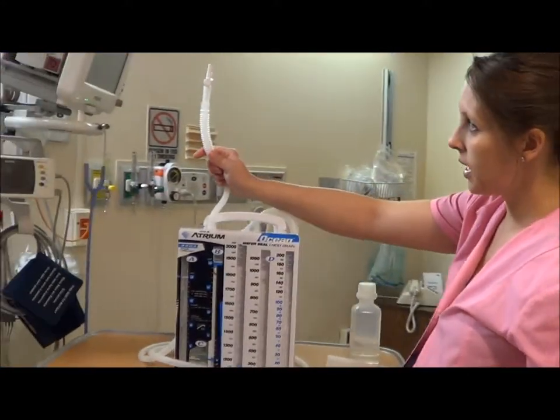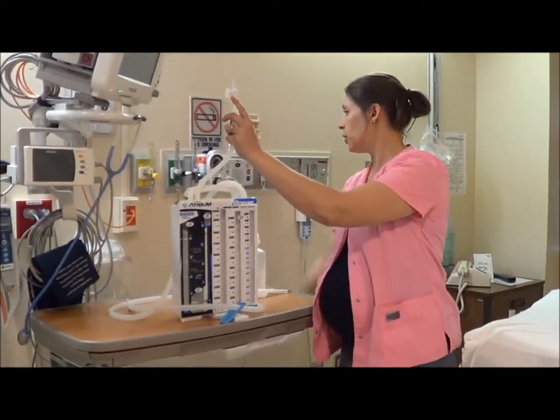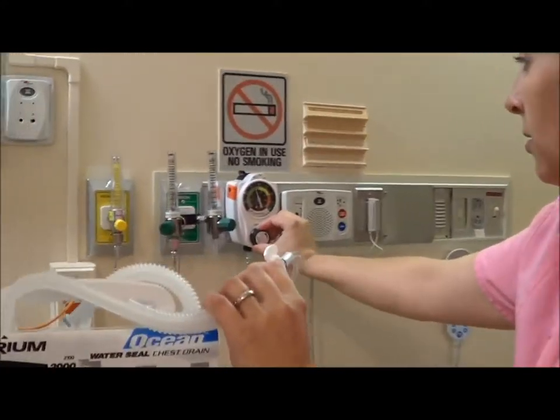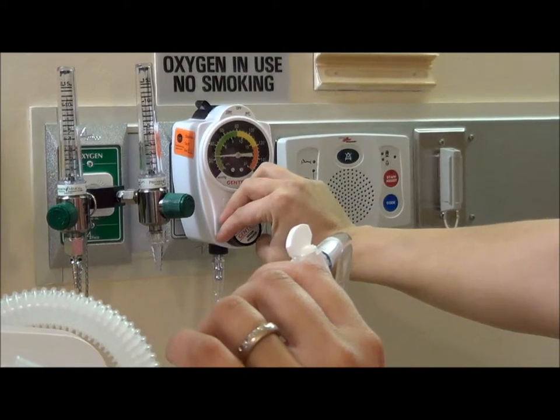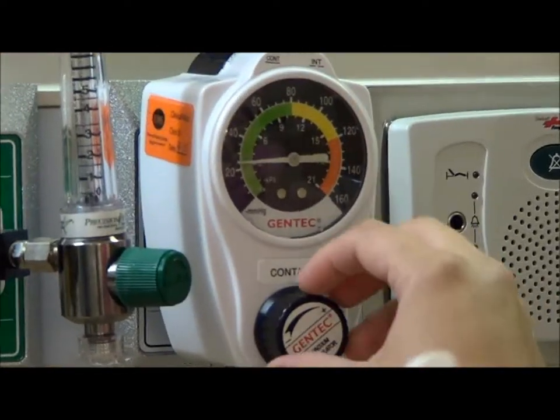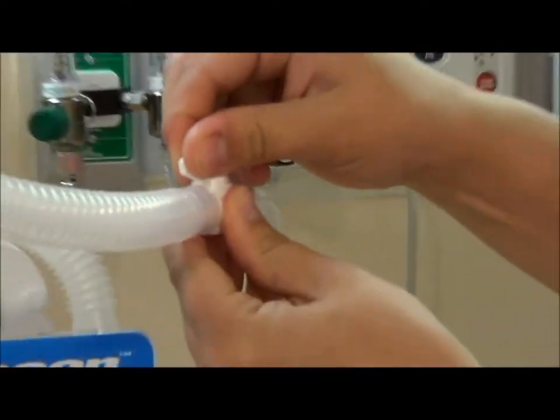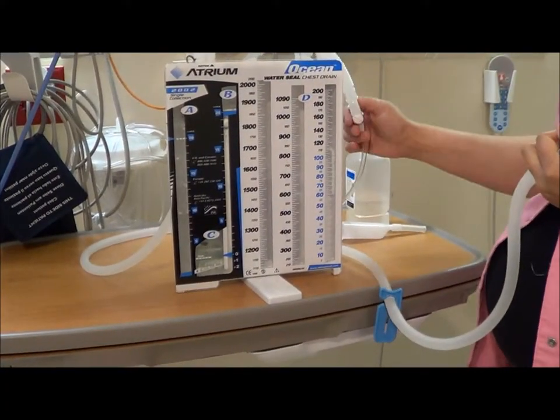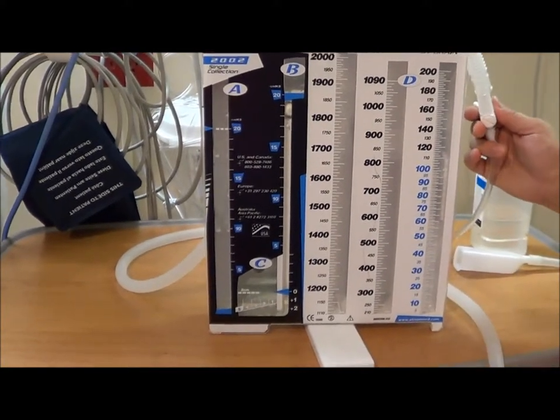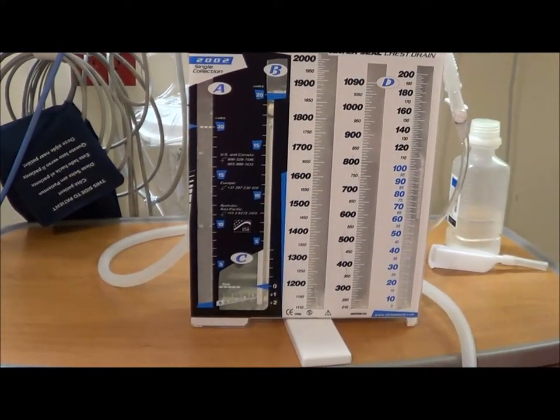Take that tube and the port that had the funnel on it with the stopcock, and hook it up directly to your wall suction. Then turn on your wall suction to continuous. It doesn't matter where it is on the dial. You can also use the stopcock to adjust the suction as well. You should see bubbling in chamber A — they always talk about a gentle bubbling, and that's probably as gentle as you'll really get it to go.